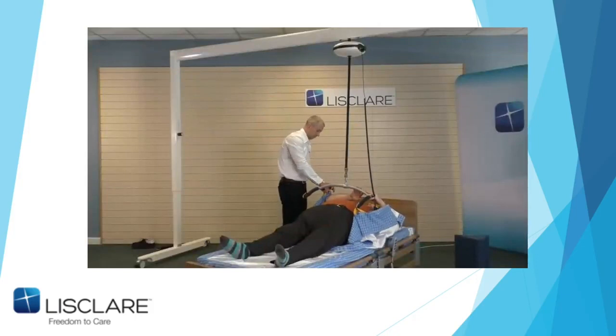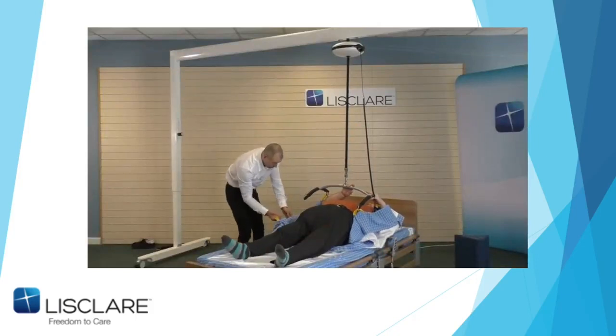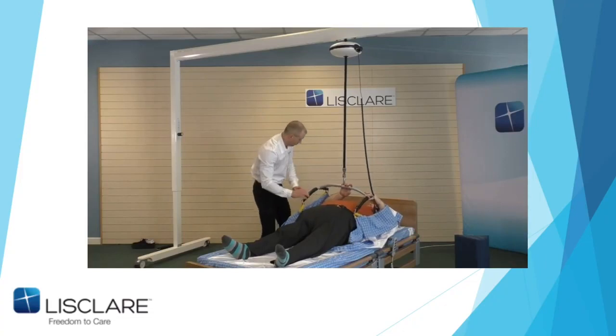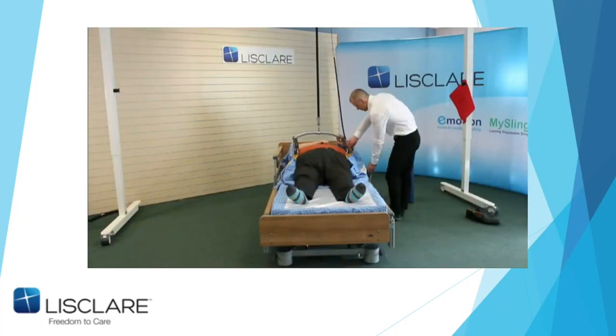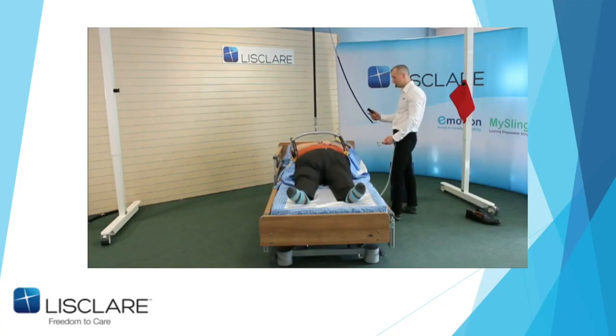So at this point, when he's got that on, he'll lift the side rail up again. If you don't mind, John, when you're finished getting the loops on, please and thank you. Thank you, John. And then he's going to come round here, because all the controls are there at the minute. And basically, the bed, I don't know whether it's low enough, John, but you can take it up in height. Just shimmy my bum. To the height of the hoist, John.